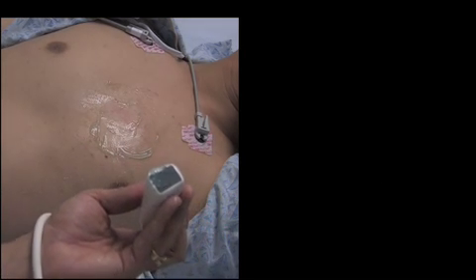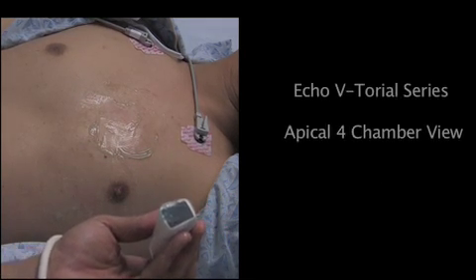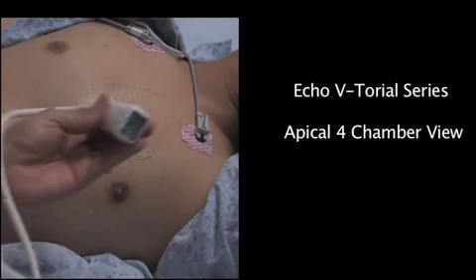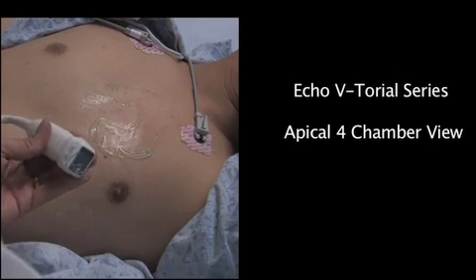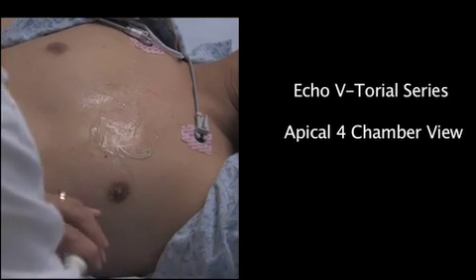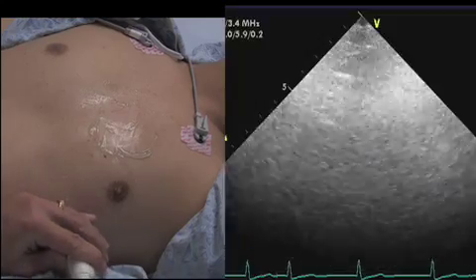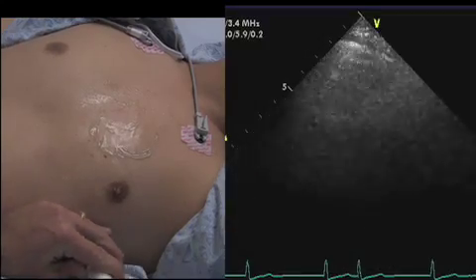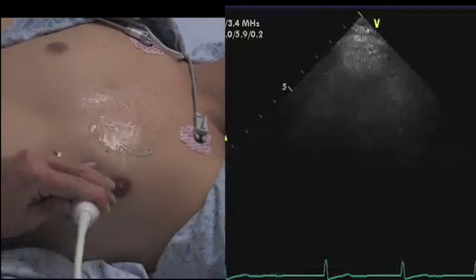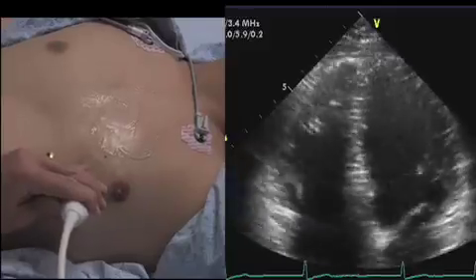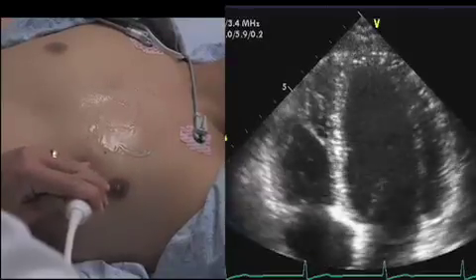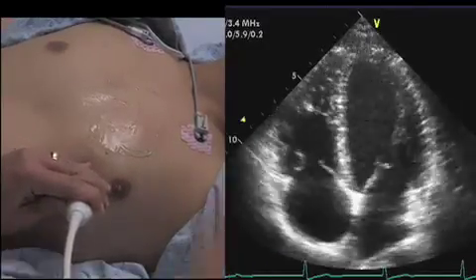Now we're going to work on finding the best apical views. I'm going to put the probe down and do my circle survey — go window shopping and find where the brightest image is for my apicals.